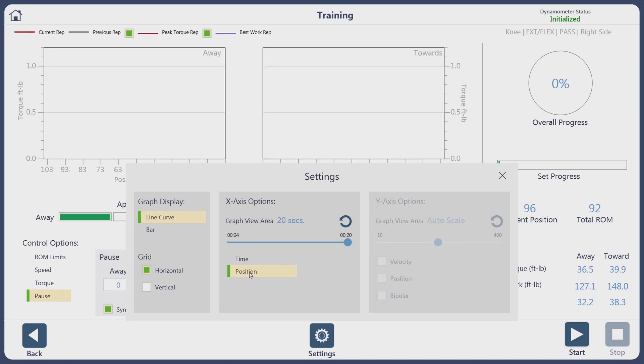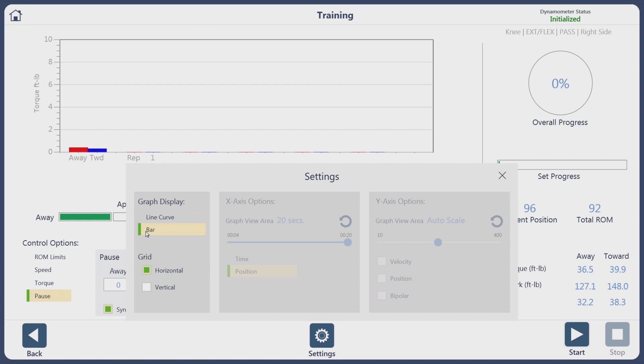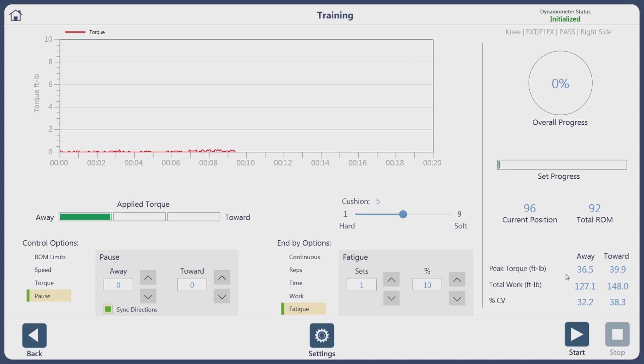Back to this screen — we can go to a position-based curve, which separates your muscle groups. We can also show bar graphs for up and down while information is gathered. On the right side you can see their peak torque, total work, and coefficient of variance for that set.